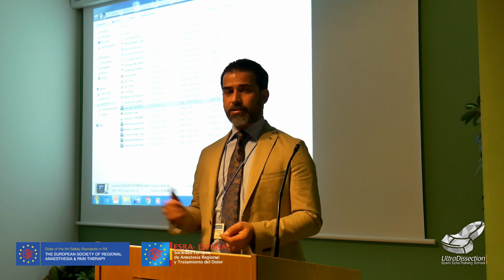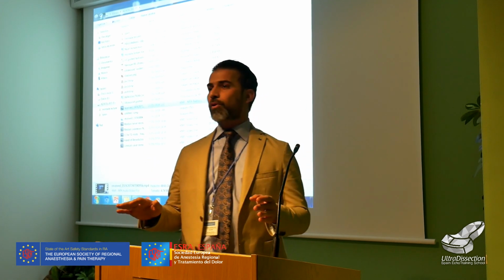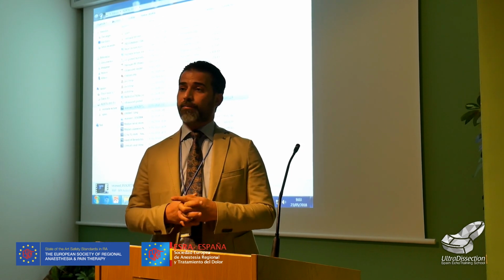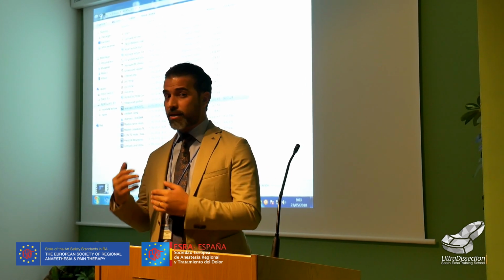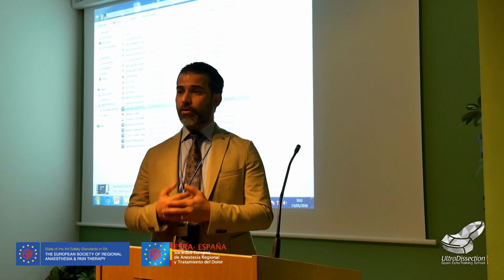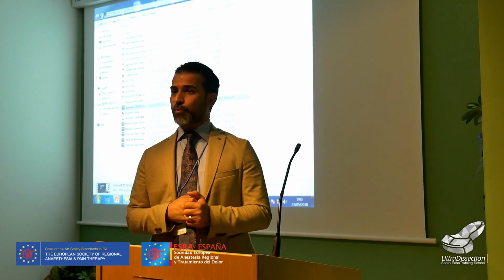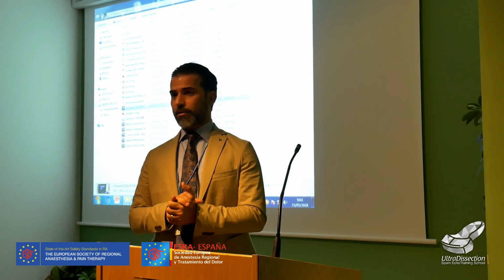But some procedures like cervical, definitely no role of the fluoroscope in my practice. No role of fluoroscope or CT guidance, because in cervical you can do all extraforaminal from C3 to T1 by ultrasound, no need for any fluoroscope.